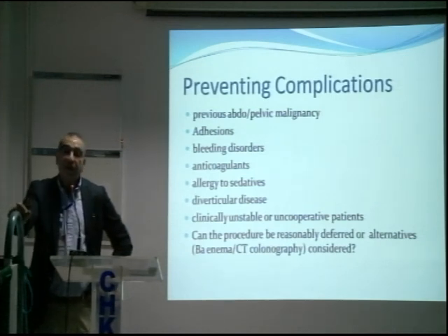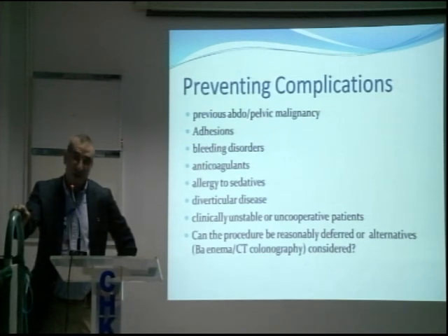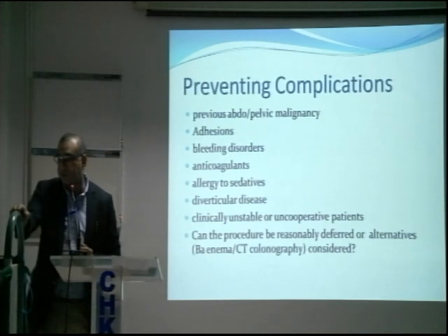Again, if the patient has extensive diverticular disease, the risk is that you might mistake the diverticulum for a lumen and go through it. Fortunately, the incidence of diverticular disease is quite low in Pakistan, but in the UK we've got a very high incidence and patients have very complex diverticular disease. So if you've got something like that, it's always better to ask for senior help.